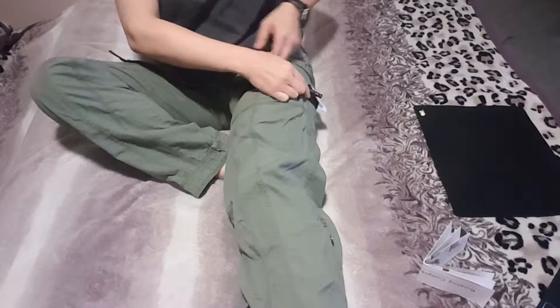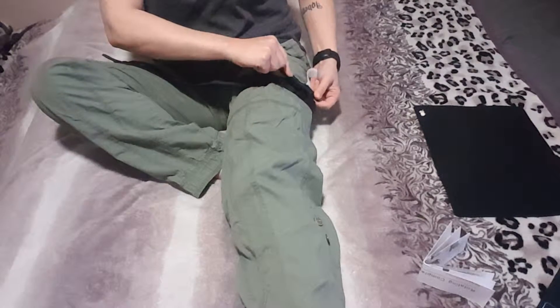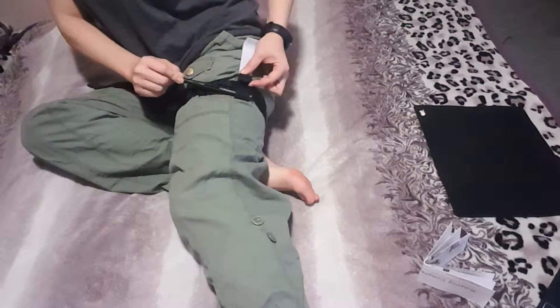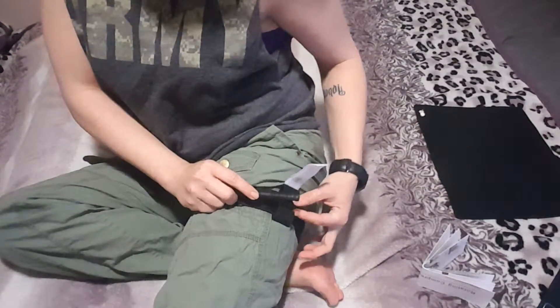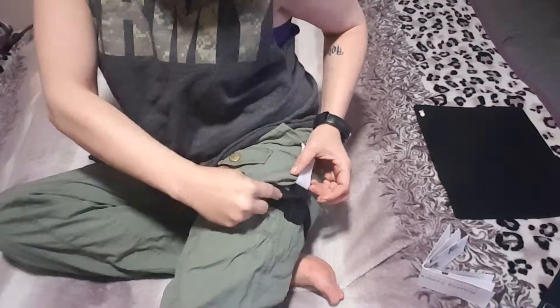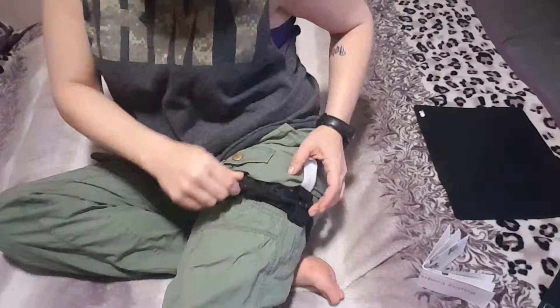Maybe one more. Yeah, no, that hurts. In that case, it would be fine if it hurt while you're out in the field — that's absolutely fine. So then there's a little buckle over here. A lot of them have a little triangle and you've got to pull that latch and pop it in. This one sits against itself, so no matter which way you turn it, it would just sit under there and hold. You know it's not going to move — it's long enough to fit through.